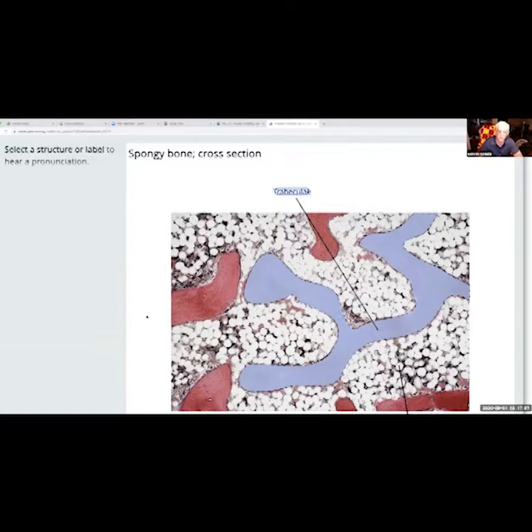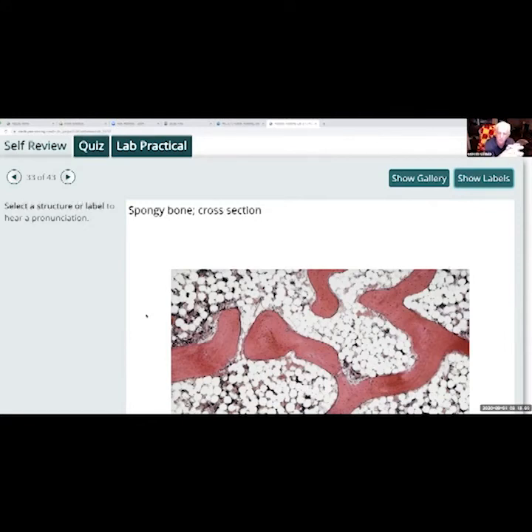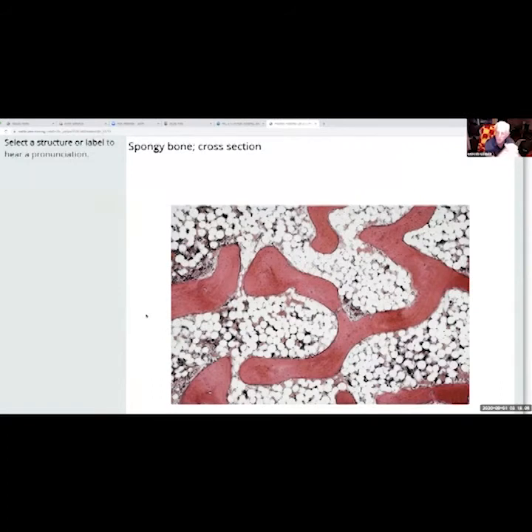All right, so look at the difference. Remember, compact bone had the bone in these circles stuck together next to each other, no spaces, very thick. Look at this. This has spaces everywhere. You look at all the space around it. This is trabecular bone, or spongy bone. It forms a web-like appearance if you look at it on an X-ray.